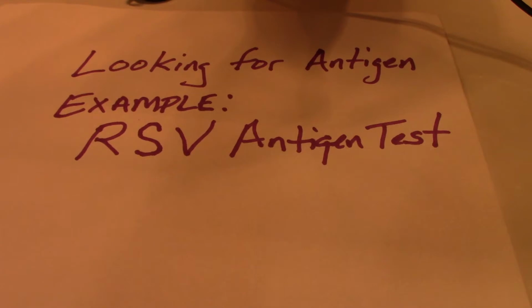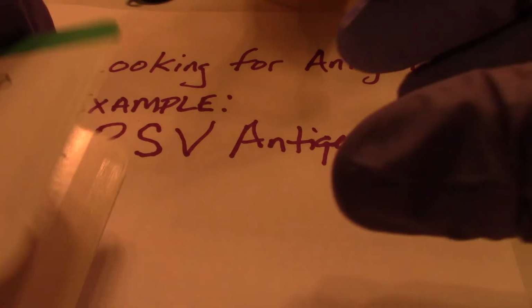This is performed on a nasopharyngeal swab or nasal aspirate from the patient, and the procedure is somehow capturing that antigen and detecting it using an impregnated membrane.